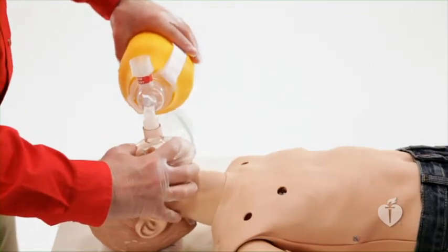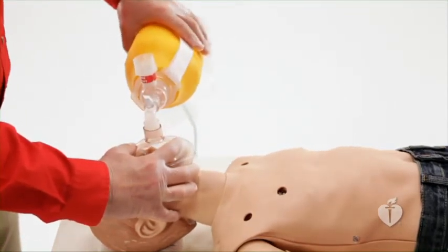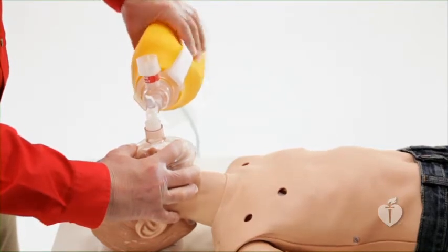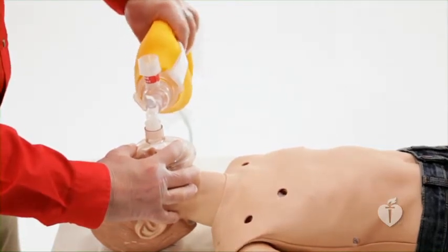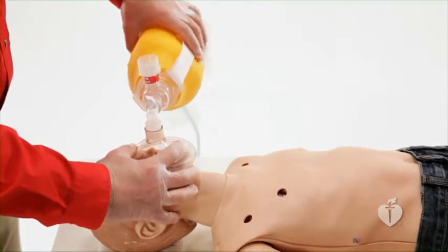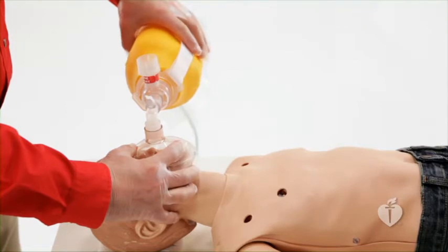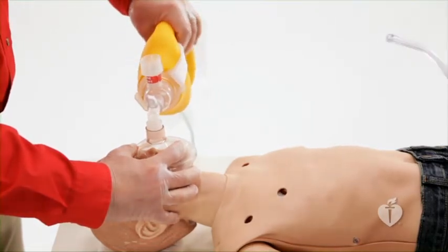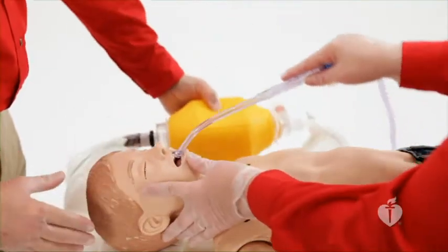Adequate pre-oxygenation should be provided. Pre-oxygenation is the administration of 100% oxygen by mask for at least 3 minutes with normal tidal volume breaths. During pre-oxygenation, oxygen replaces nitrogen in the lung and lengthens the time before desaturation occurs during intubation. Suction the oropharynx if necessary.